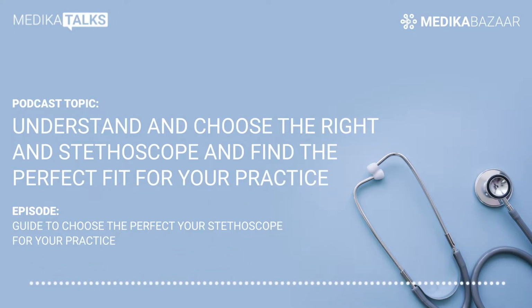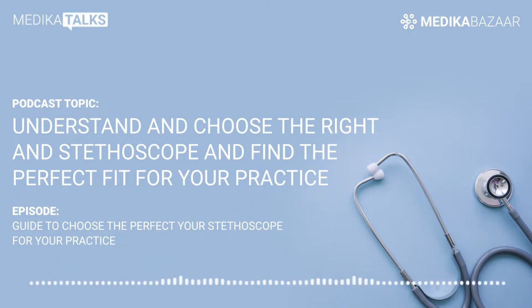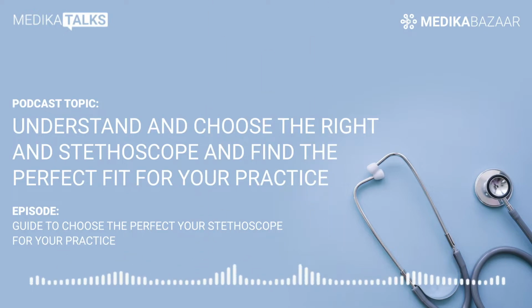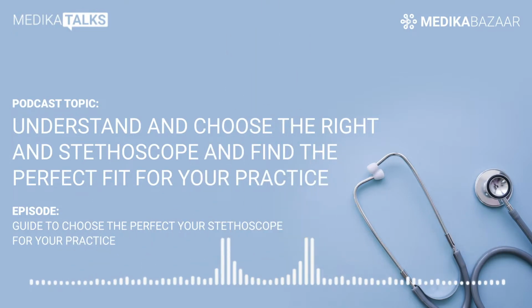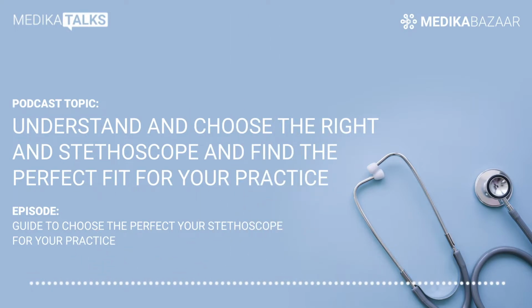Fetal stethoscope. A fetal stethoscope is an acoustic stethoscope that is used to listen to the sound of the fetus. The stethoscope that comes in the shape of a trumpet can diagnose abnormalities in pregnant women. It is placed against the abdomen of a pregnant woman to hear the sound of a fetus, and it is also known as a fetoscope.